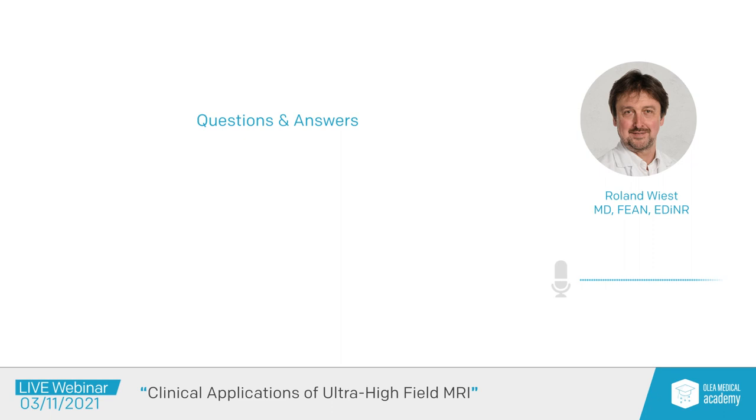Thank you. The next question concerns the fingerprinting pattern recognition. You showed us in your lecture how the recognition of a 2HG peak can correlate with IDH mutation and perhaps identify patients with a better outcome, obviously a strong clinical correlation. Can you give us other examples of how pattern recognition or fingerprinting is easier or the capability is increased in high field MRI as opposed to low field MRI for other disease types?